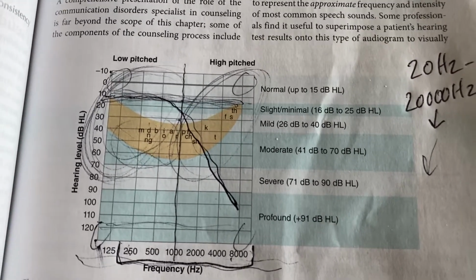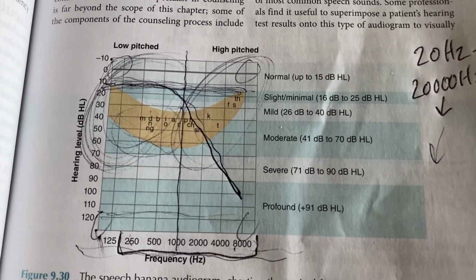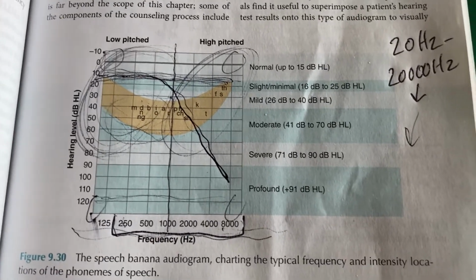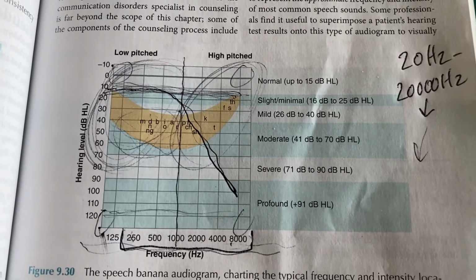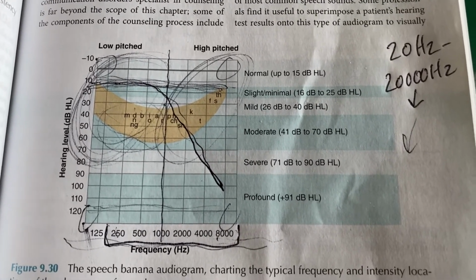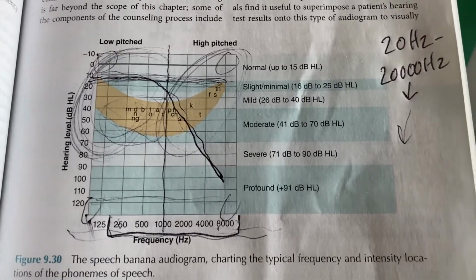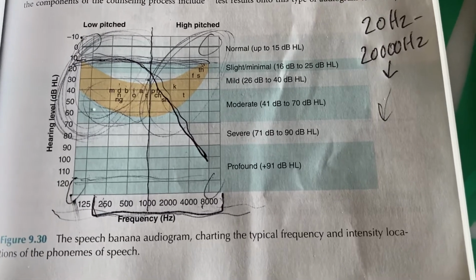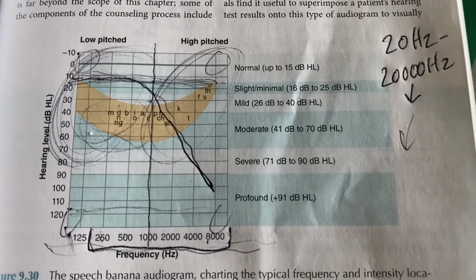You have a severe high frequency hearing loss, meaning that you can hear low pitches within normal limits, but you can't hear the high pitches. Speech ends up sounding very vowely. Speech sounds loud, but it doesn't sound clear. You can hear speech, but you can't understand it.